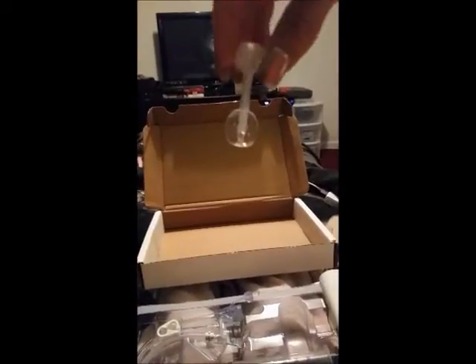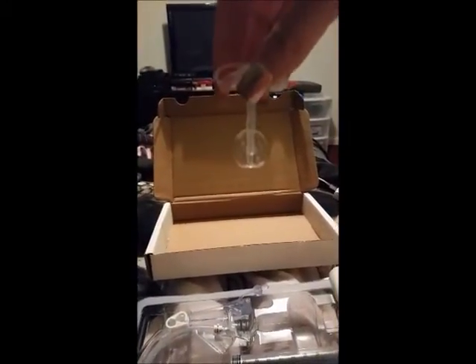And we're just going to, hold on one second. Like I said, I'm winging this. Gotta love blooper reels, huh? And so we pull it out, and the balloon is not deflating, so we know it's good. So we're just going to deflate it, and I'm going to go ahead and pull my old one out.